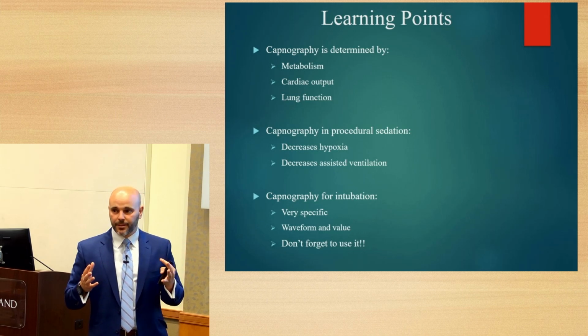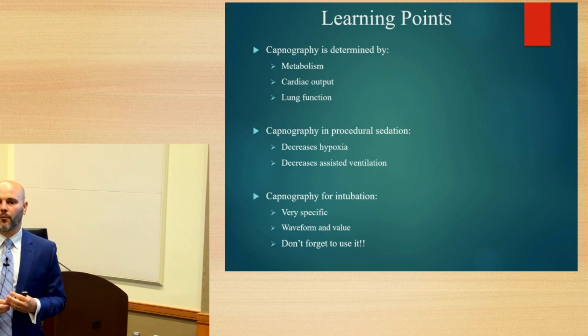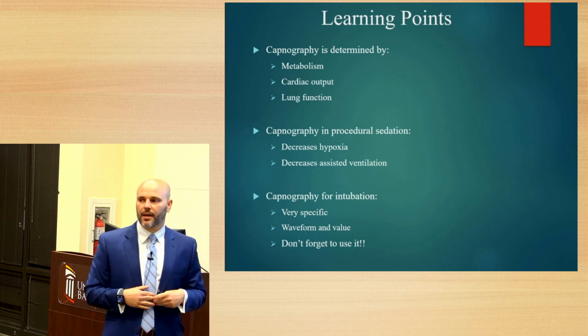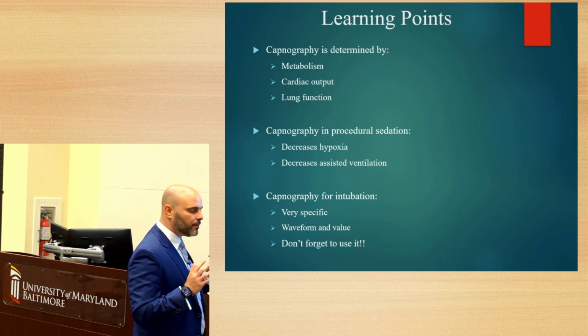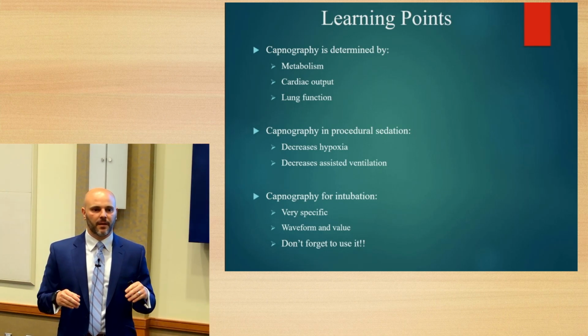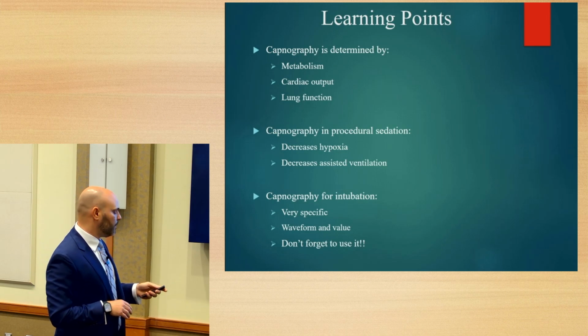Dead space can contribute to that, and you separate that out with the CO2 gap. You need to keep that in mind when you're monitoring and using end tidal CO2. In procedural sedation, you're going to have decreased hypoxic episodes and assisted ventilations. And for intubation, please try to use it. You get immediate feedback. If it's in, you get the right tracing, and it's very, very helpful and useful.